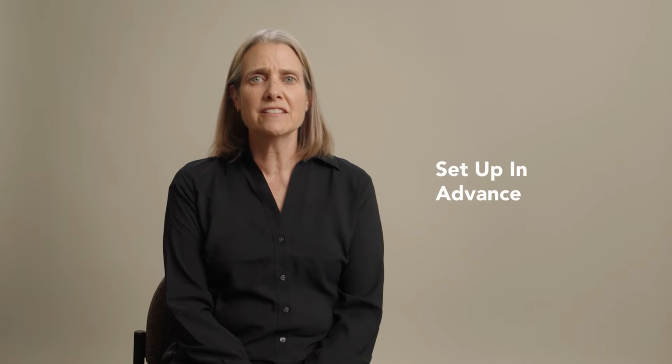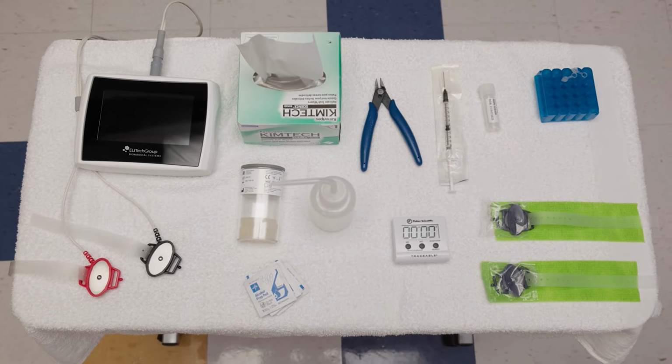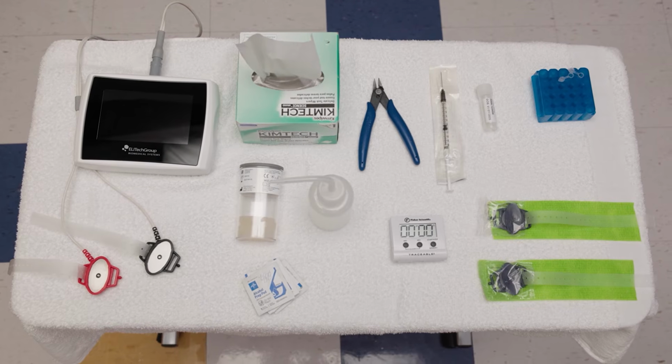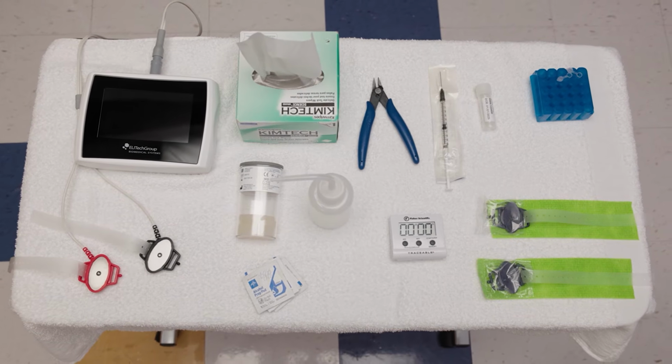Setting up in advance is helpful, especially with infants or toddlers. Preparing some of the collection supplies before the patient arrives, rather than during the 5-minute induction window, can make the process smoother since your hands may not be free during induction. We'll walk you through the setup.